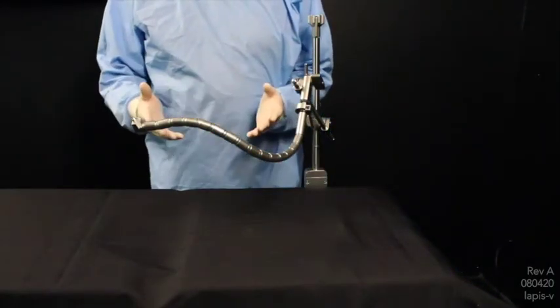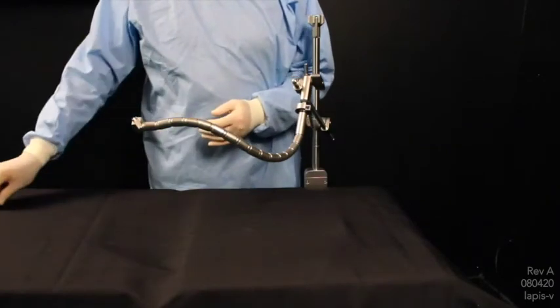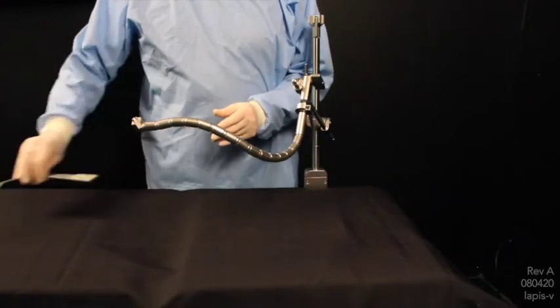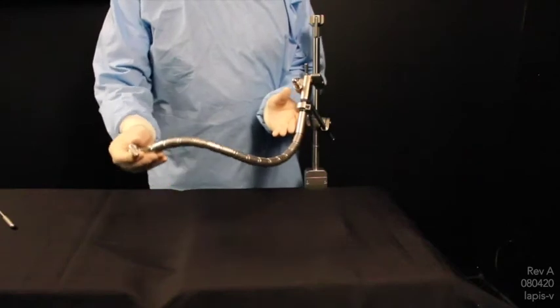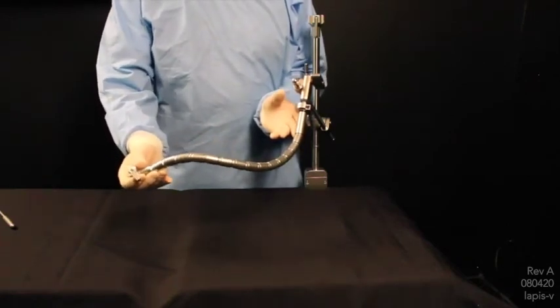In most cases, this is not entirely recommended to use as an instrument holder, for instance using a Nathanson hook. The reason is that the flexibility in this may not be strong enough to maintain a position of holding an organ.